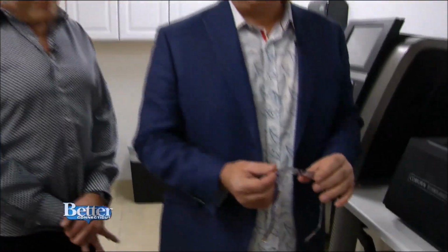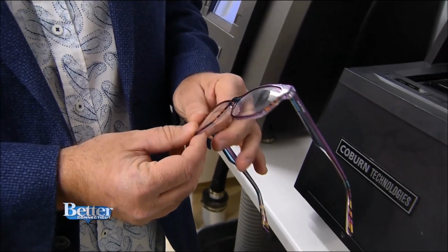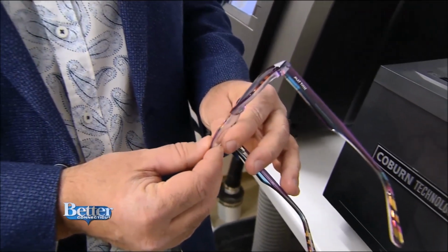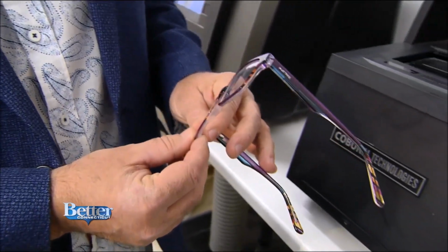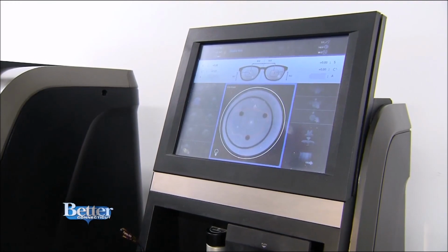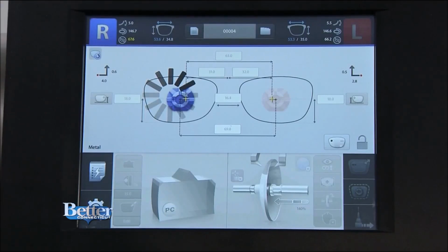Okay, so I can come in with my frames, and you'll fit the lenses to those frames. Absolutely. And how does that happen here on premises? It does. Take a look. Those are someone's frames, and you can see it's very beautiful. Actually made by a company called Matisse, made in Italy. They're actually hand painted by an individual, so there's not 2 of these in the world. But the lenses, no good. So Tom is going to make new ones using these 2 machines.